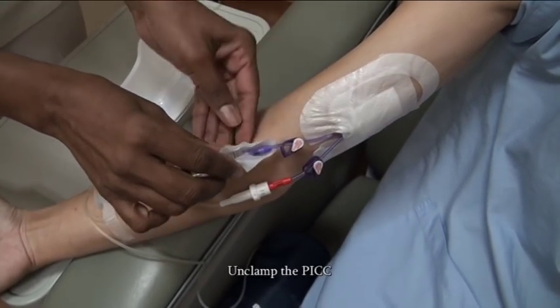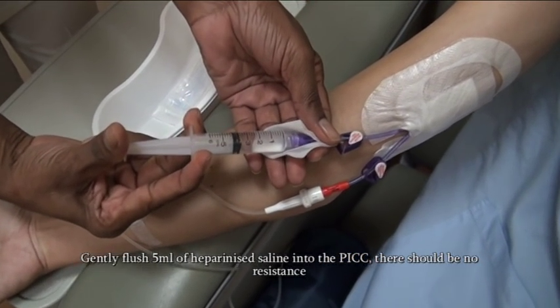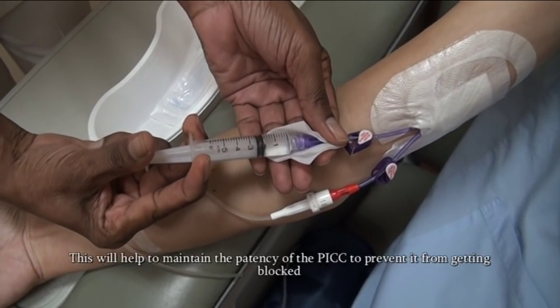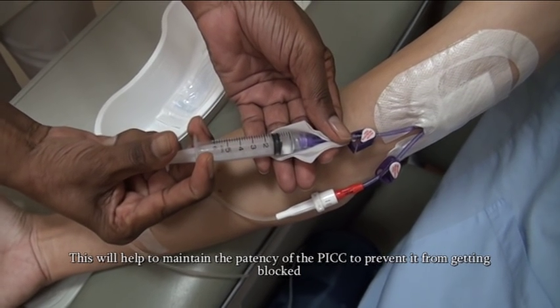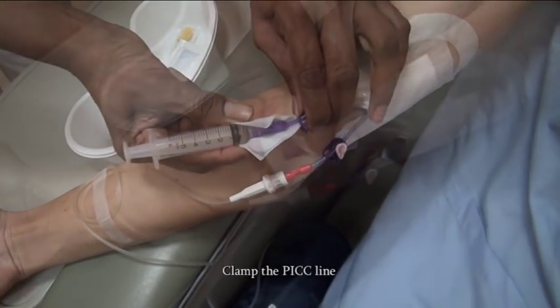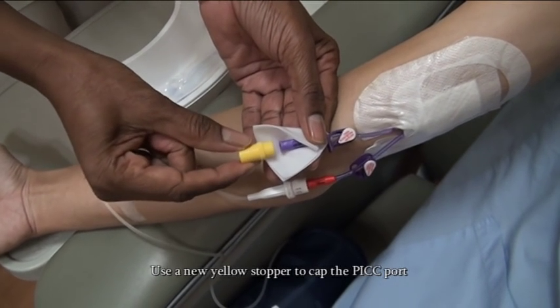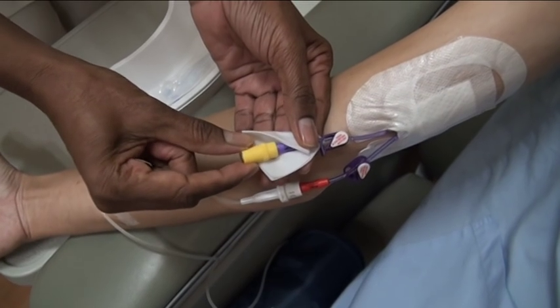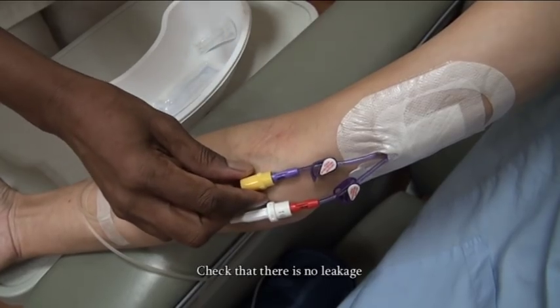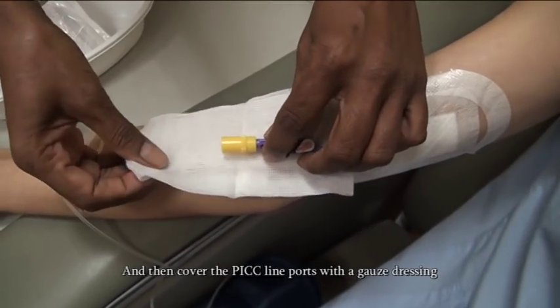Connect the 5ml syringe securely to the PICC port. Unclamp the PICC. Gently flush 5ml of heparinized saline into the PICC — there should be no resistance. This will help to maintain the patency of the PICC line to prevent it from getting blocked. Clamp the PICC line when done. Use a new yellow stopper to cap the PICC port. Check that there is no leakage and then cover the PICC line ports with a gauze dressing.